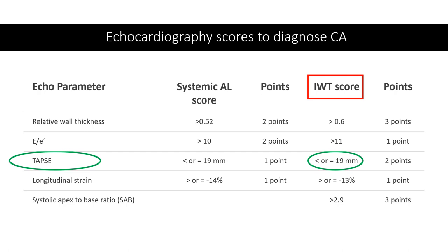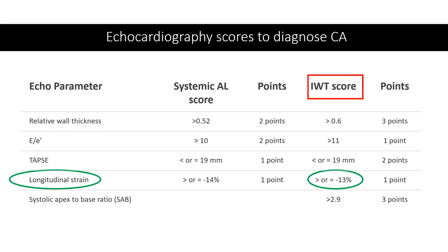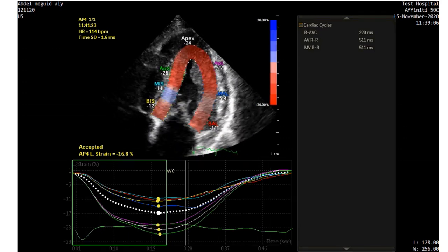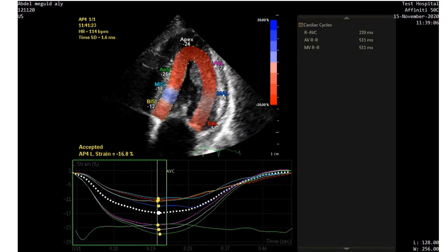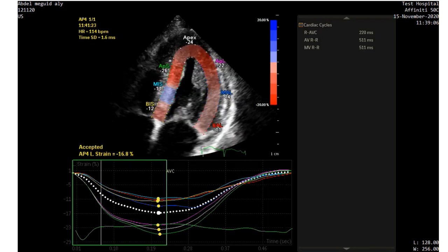Next we move to the TAPSE. It's a simple easy measurement — our TAPSE was 14.1 millimeters, which is less than 19 millimeters, so our patient takes two points.